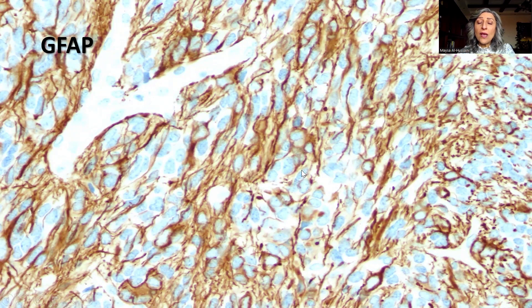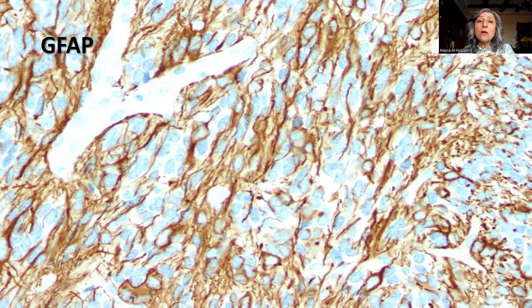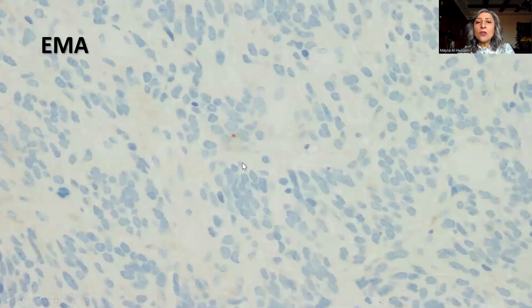Given the age and location, ependymoma was favored and GFAP was ordered. As you can see, there is some positivity of the tumor cells with GFAP. There are scattered tumor cells that are positive, along with minimal vascular proliferation.